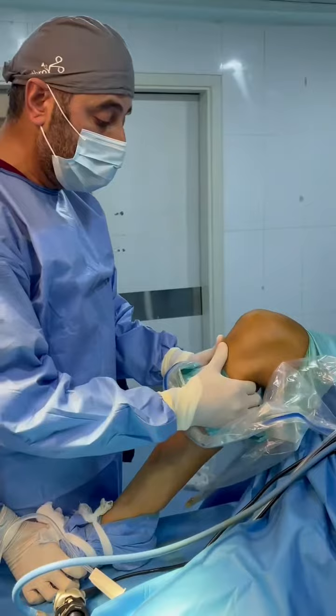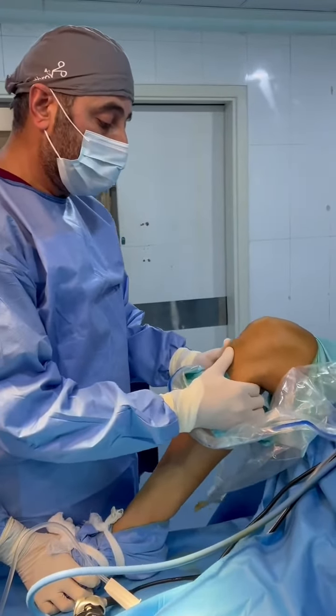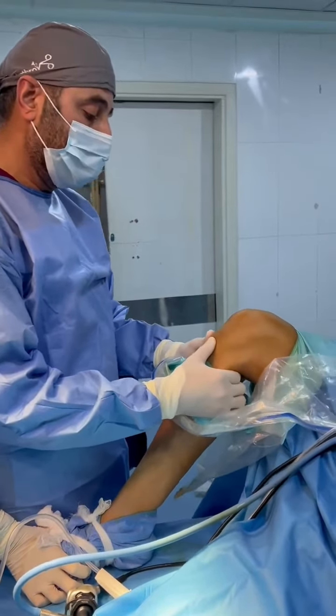So you can see this anterior drawer is positive. Anterior drawer is positive. So this is an unstable right knee. Now we are going to reconstruct it.